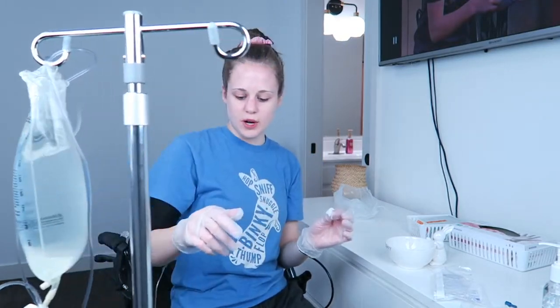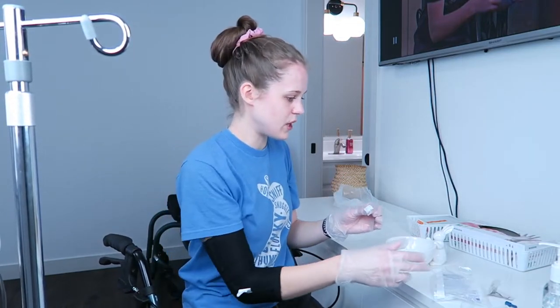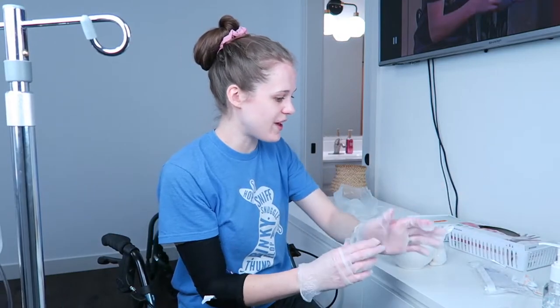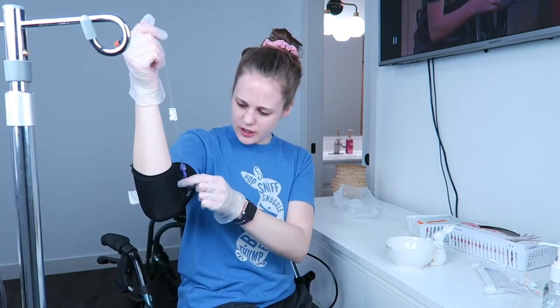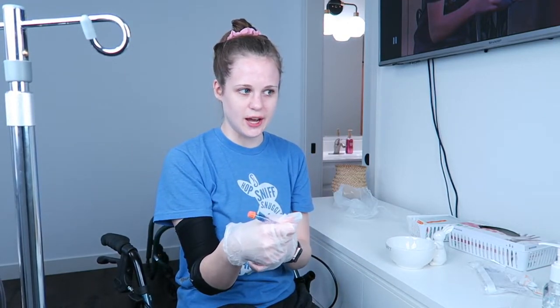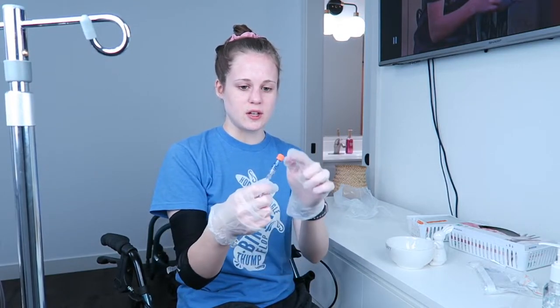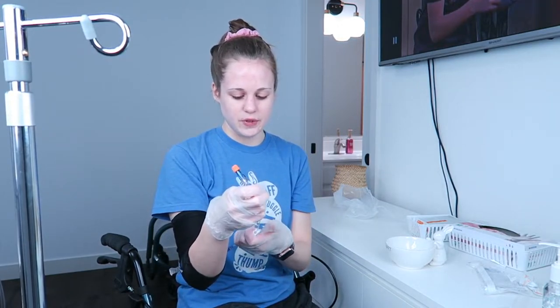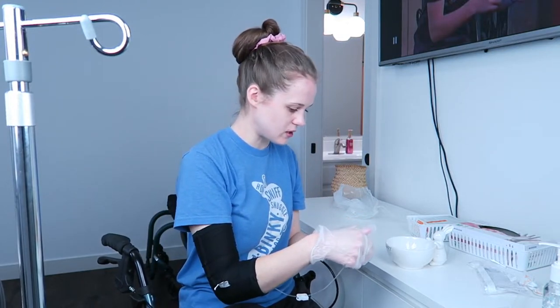So my tubing is primed, so I'm just going to put that over there. Now I have to flush my port, or I do not have a port, flush my PICC. On my extension tubing, I just have some clips. This one's already unclipped, probably because I just had a dressing change like an hour ago and we probably didn't clamp that, but this one's clamped, and this also protects from air getting in. Just going to unclamp that.